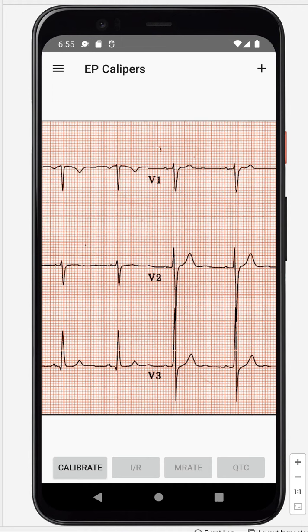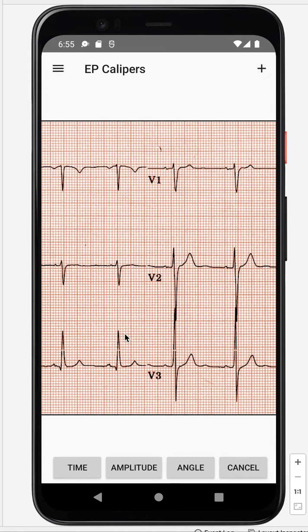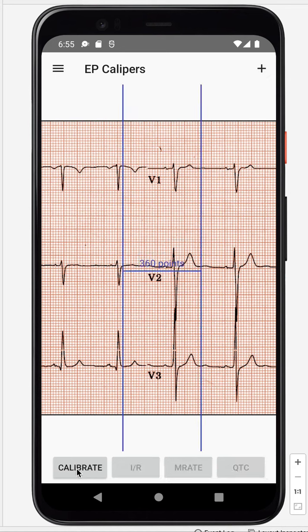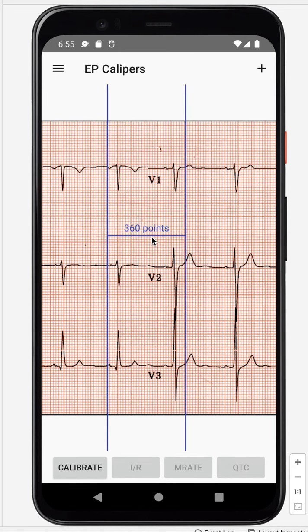To record the QTc on EP Calipers for Android, if we don't already have a caliper, we can add a caliper to the screen. The first thing we have to do is calibrate the caliper.